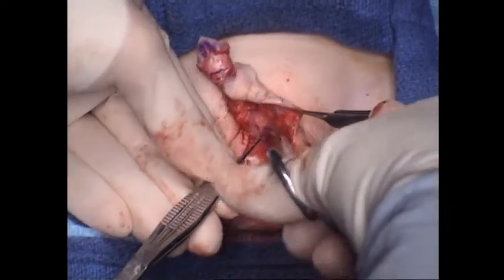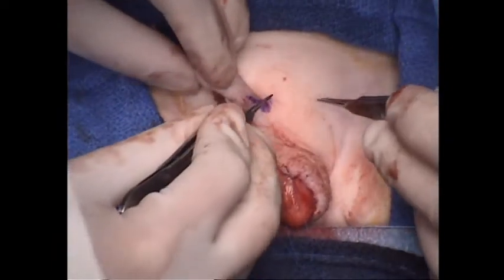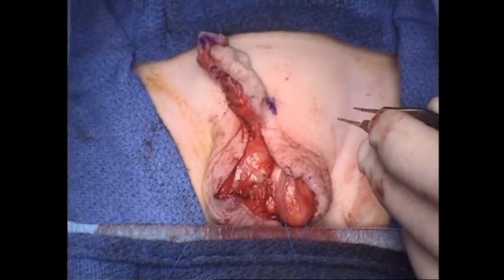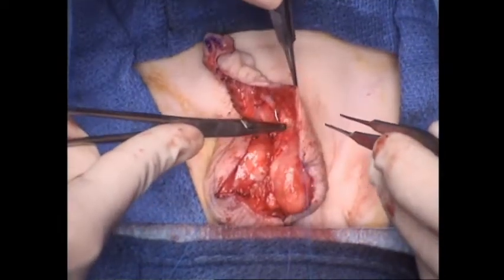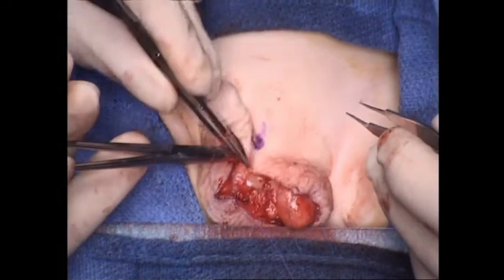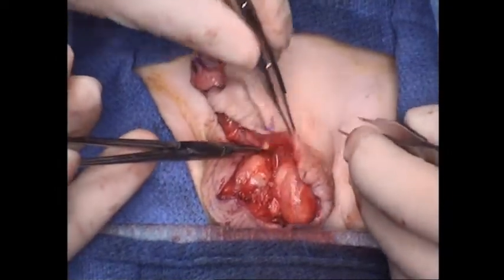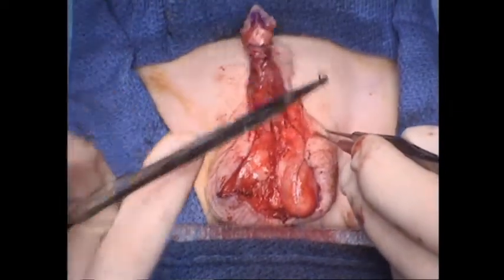So by removing some of this thickened dartos, I'm just able to stretch this skin out, because most commonly, you're shorter of skin here on the left side of the penis than you are on the right side. And so you want to give as much symmetry as you can to things. So by placing those marks here, I can place this stitch and be sure that I'm exactly where my mark is. That's a nice little trick to use.